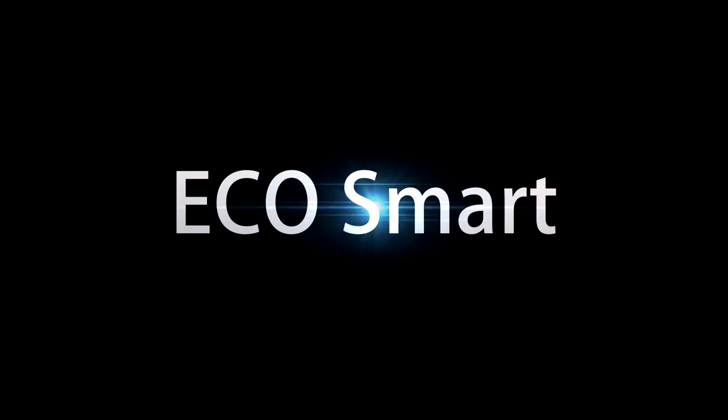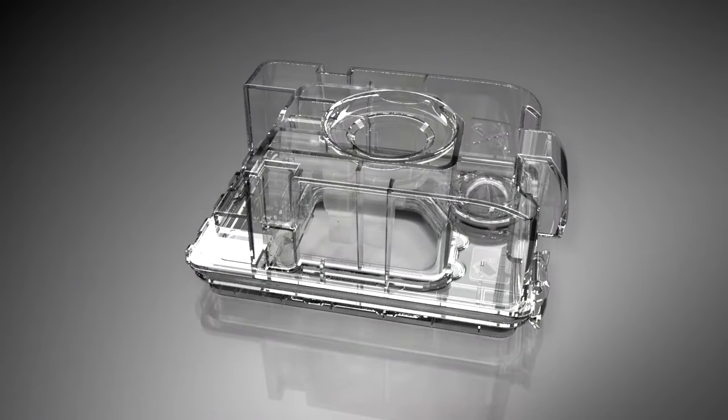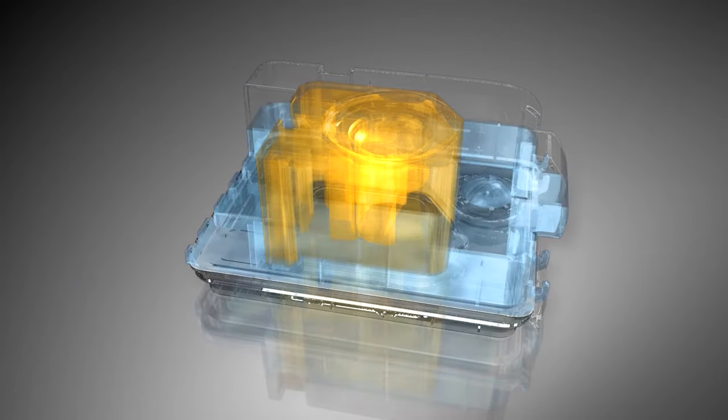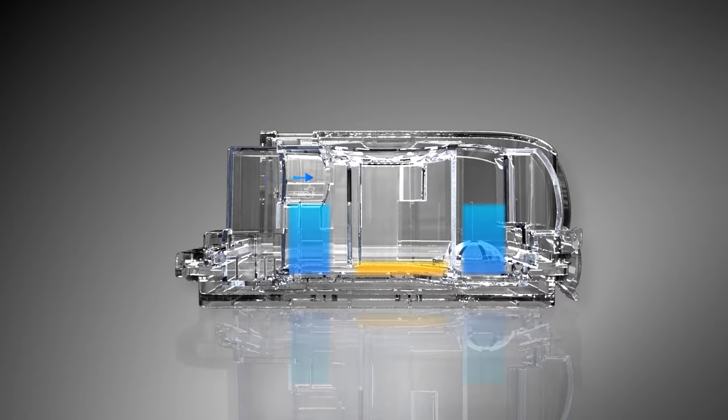EcoSmart. The EcoSmart heating system features an innovative dual water chamber design — a heating chamber versus a storage chamber. Optimum humidity and temperature are delivered to the patient after traveling through the heating chamber, with accurate water quantity control and real-time compensation from the storage chamber.